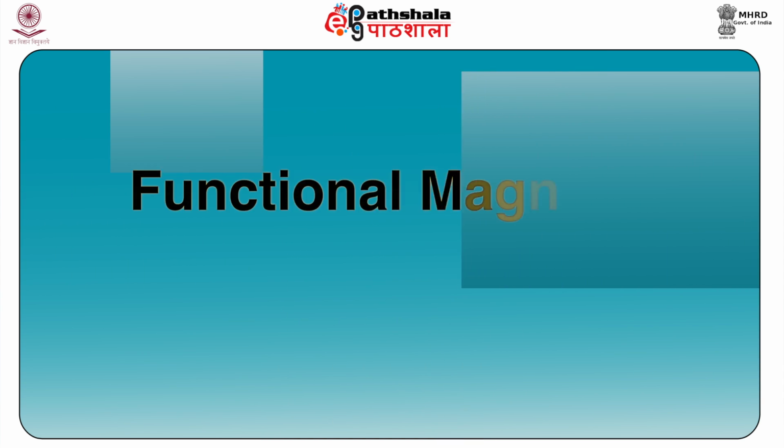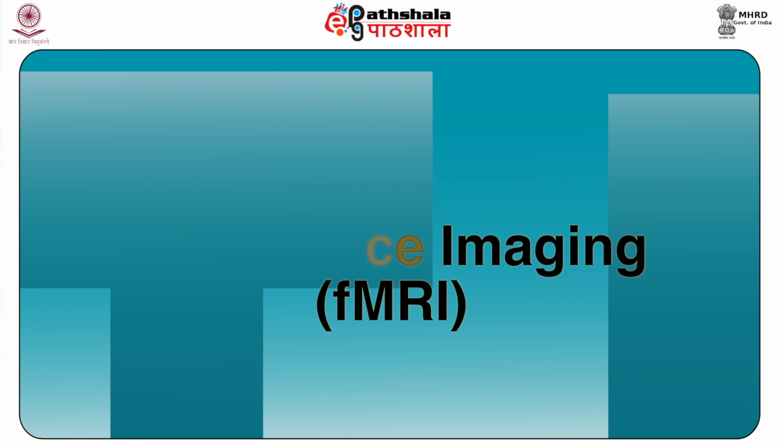When the radio frequency field is suddenly turned off, the atomic nuclei release electromagnetic energy as they relax. This change in energy is used as a measure to produce images of the brain. Any structural defects of the brain, even in some deeper layers, can be detected through this technique. Functional magnetic resonance imaging, known as fMRI. One of the limitations of MRI is that it is a slow process. Consequently, the image reveals only stationary structures. An improved apparatus called echo-planar MRI has been devised, which is fast enough to observe the blood flowing through the brain. Rapid changes in the brain activity thus can be measured through this technique.